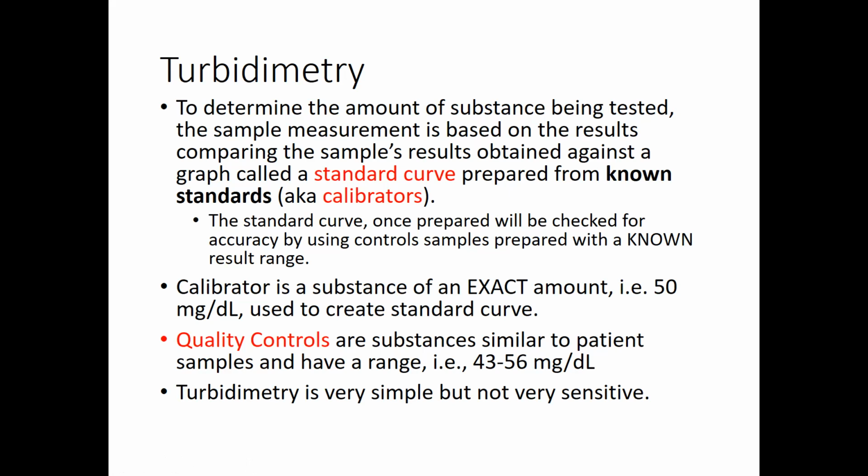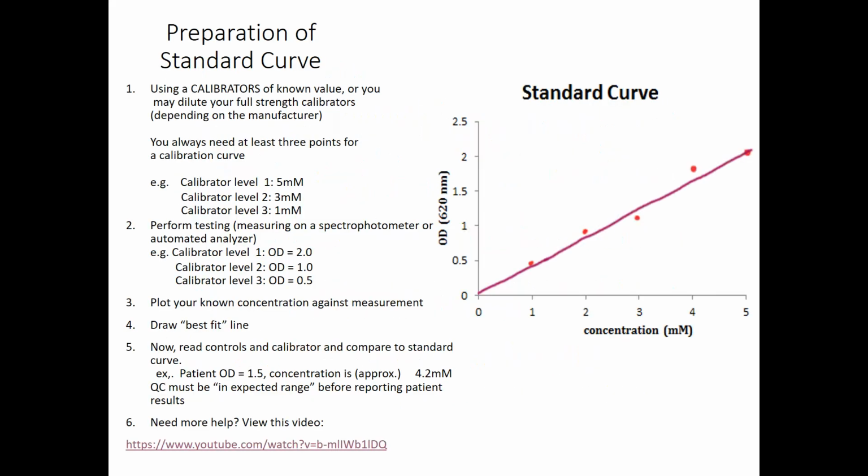Turbidimetric testing is very simple, light passing through, but it's not that sensitive. It's not a great test method because it's subject to a lot of error.